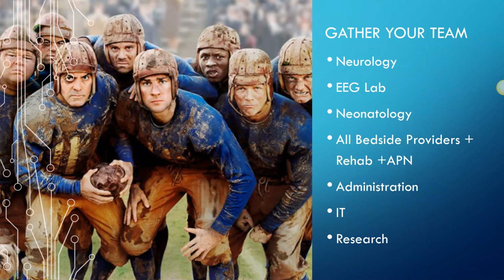So gathering your team from neurology, from your EEG and diagnostics labs, neonatology, all your bedside providers, potentially rehab, RTs, your advanced practice nurses, administration, very important. Neuro NICUs and aEEG programs are expensive. Your IT department for storage and archiving, and even your research team, and deciding what you're going to do with all of that as well.